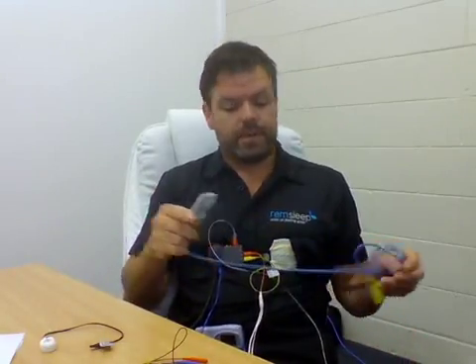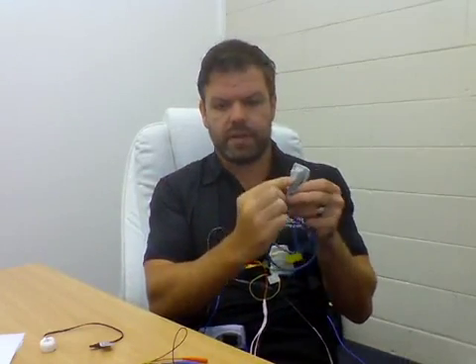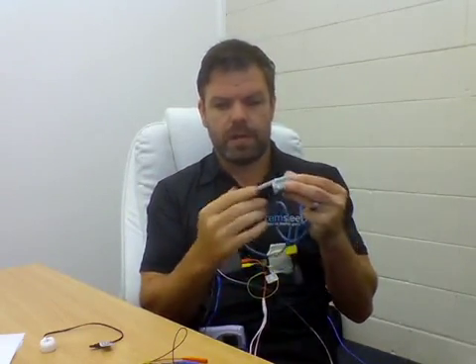That's the cannula, and then the last step is your oximetry. The oximeter has a little fingernail just on the top here, and we basically just place our finger in it so that the cable is running on the top. You just want to see your finger just at the end there. You don't want it poking through like so. So just pass it right to the end, and then you tape it up around your finger, so it's not going to move. And then you also tape it back here a little bit as well. That way it's going to stay nice and stable through the night, and we'll get a nice oximetry trace.